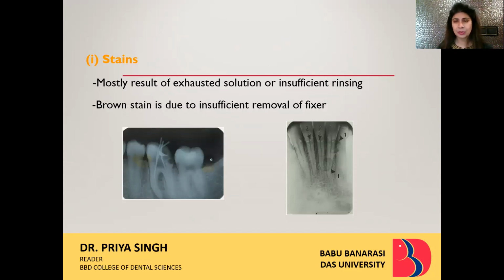So in processing you should be very sure of how it has to be done, when the IOPA film has to be rinsed and when it has to be washed. Because we don't want that everything has been done properly, but because of insufficient rinsing and insufficient washing, it leads to brown stain, maybe after a day or maybe after a week or a month. So brown stain can also lead to artifact, which at times might take time to show on the final image. So once the processing has been done, the IOPA film should be washed properly.